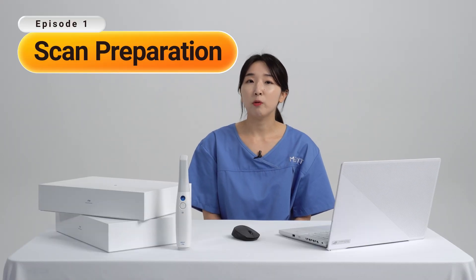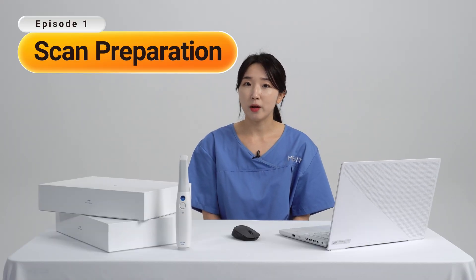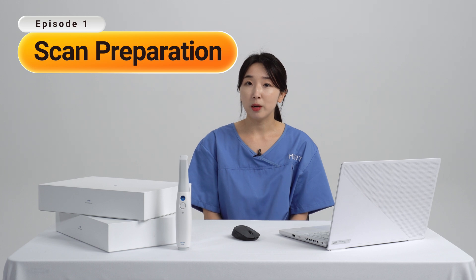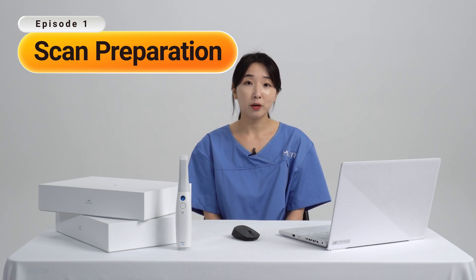There are a few things to do before we start scanning. We'll use the MeditLink program to scan, so let's create an account.